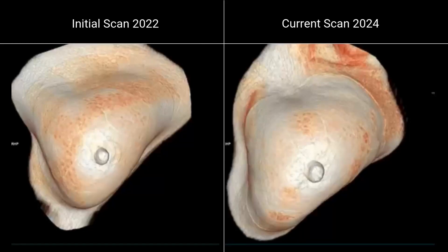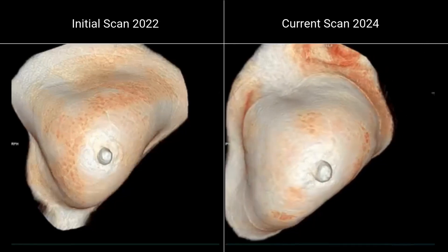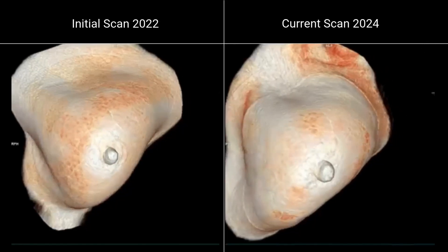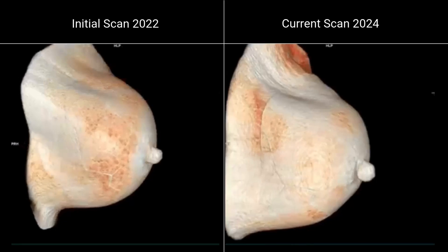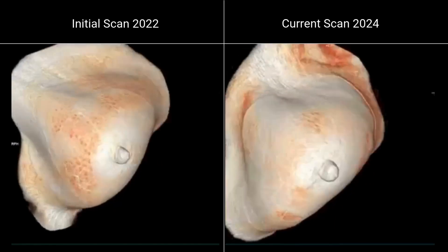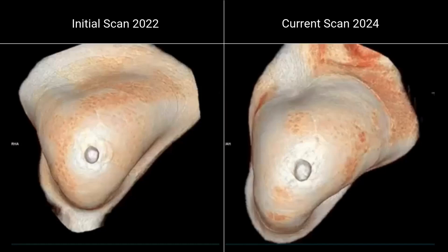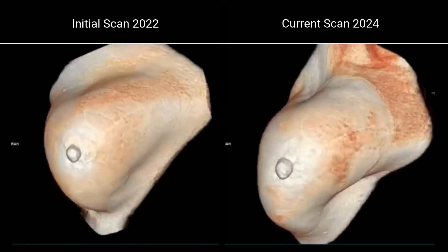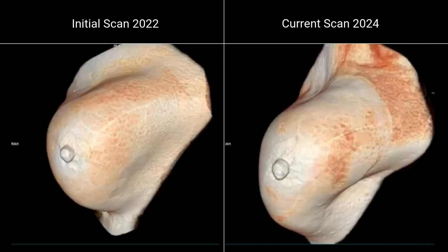Hello everybody, it's me again. I want to show you a very nice example of daily usage of the Mama CT for breast imaging. This is a comparison between the same breast — the left breast was scanned two years ago and the right one is an actual imaging from the last days.